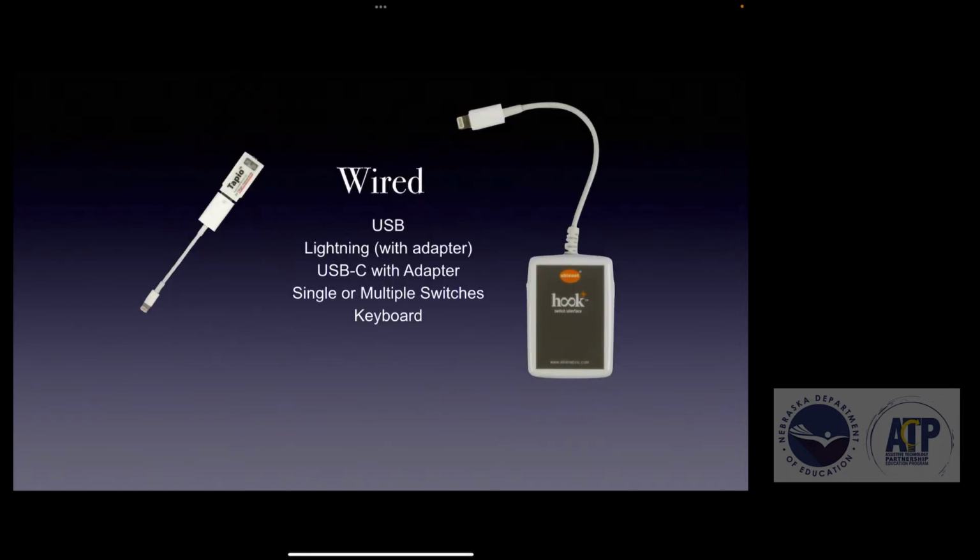So wired, you actually plug right into the charging port on your iPad. There is a USB that you would typically utilize, but you're going to need a specific cable in order to do that. If you're using some of the older iPads, you're going to use a lightning adapter. The USB will plug into it, and then it will plug into the iPad. If you're using the newer iPads, you're going to need a USB-C adapter that will allow you to plug in a USB device.